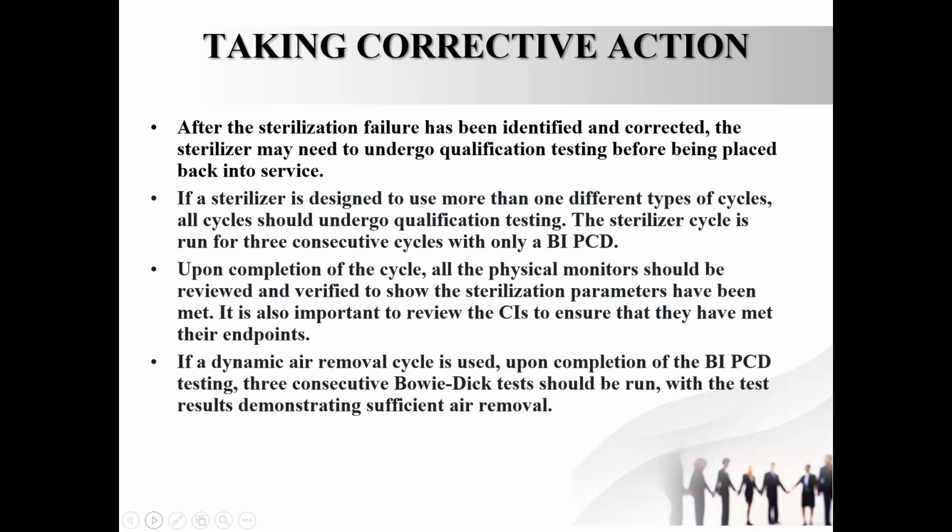If the sterilizer has more than one type of cycle, the sterilizer is run for 3 consecutive cycles with a BIPCD, and each type of cycle, like linen cycle, gravity cycle, pre-vacuum cycle, has to be tested 3 times.